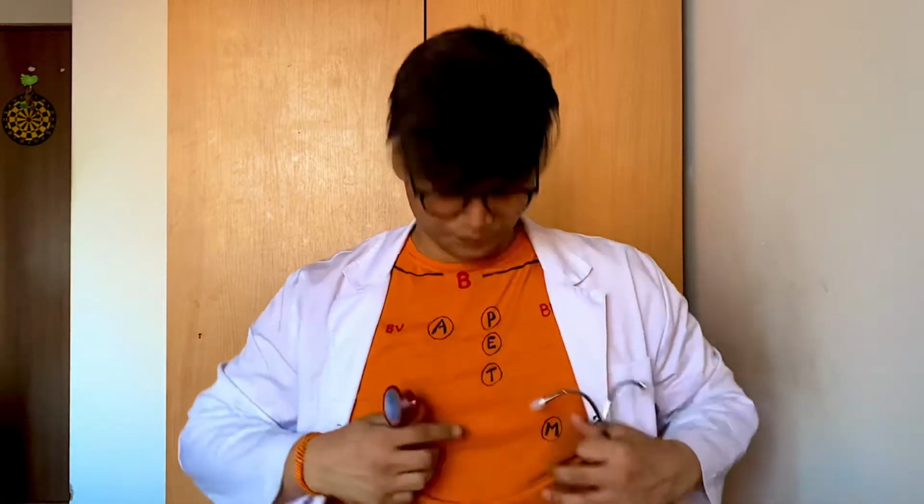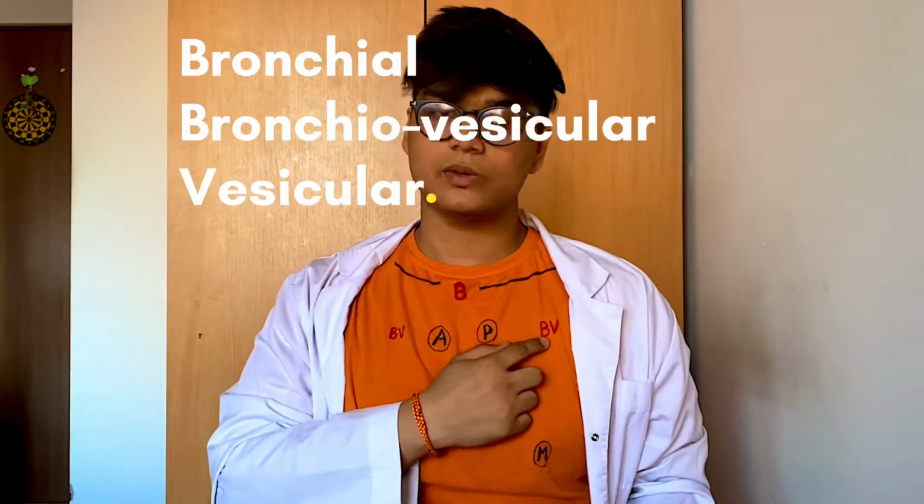Now, stethoscope is not only used for the heart, you can also use it for the pulmonary activity. For the pulmonary activity there are 3 points, that is bronchial, bronchovesicular and vesicular. For the bronchial, this is between the clavicle, you can see here is the bronchial, and for the bronchovesicular it is the mid-clavicular line, from the mid-clavicular line to the second intercostal space, and vesicular is throughout the thoracic cavity, the anterior, the posterior and the lateral. Here we focus on the sounds like crackles, wheezing and the pulmonary friction.